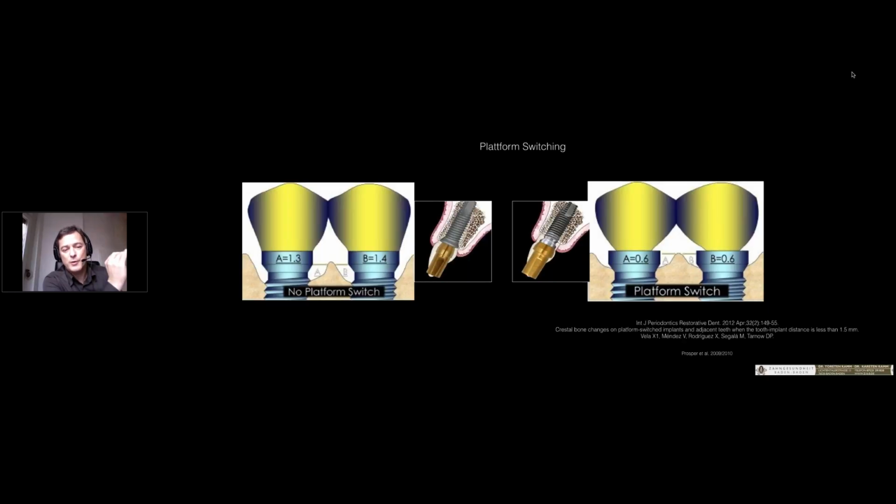In most cases, we get less bone loss, because our little connection between the abutment and the implant goes much farther away from the bone contact. This is the reason the most famous speakers said that you don't lose so much bone. It's the same if you use a one-piece implant: you have no bone loss, because you don't need a platform switch.